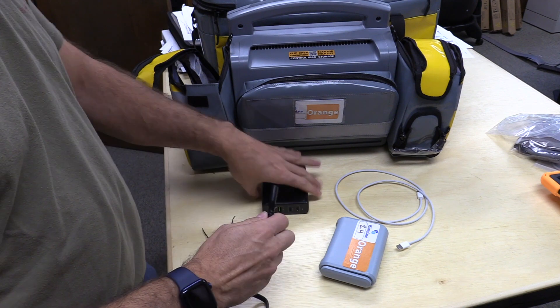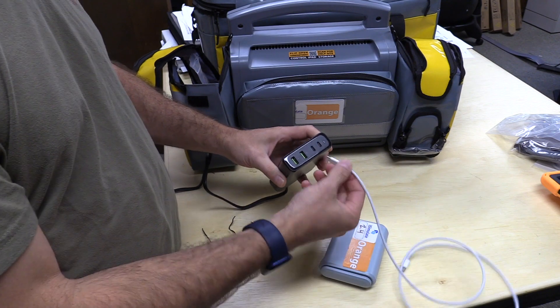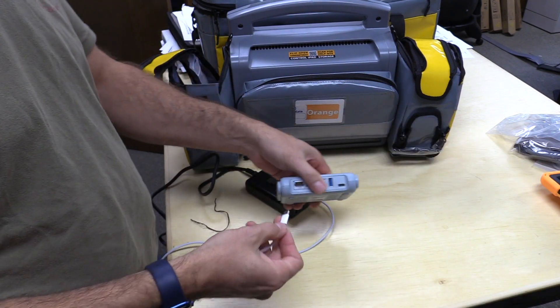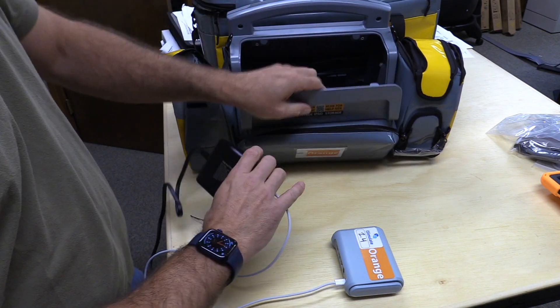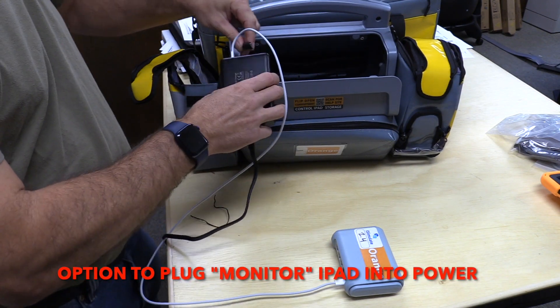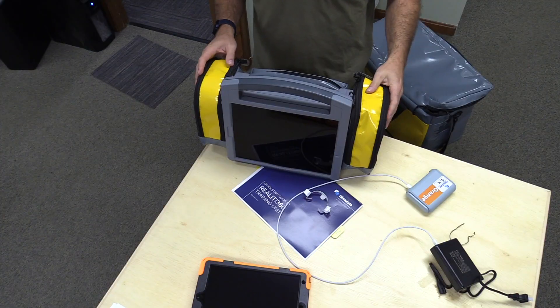To power the router, simply match the USB-C plug to the router and plug the USB hub into an AC wall outlet. You can also power the router off of the supplied battery power supply, and if necessary, plug your monitor iPad into the USB hub within the case to keep that charged.